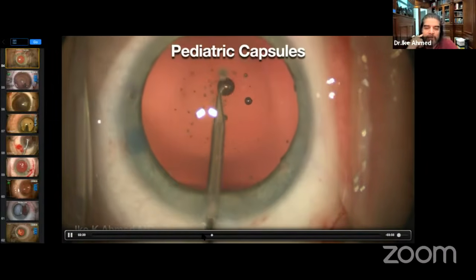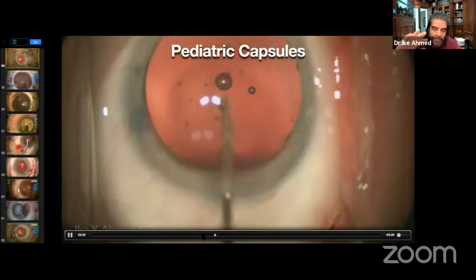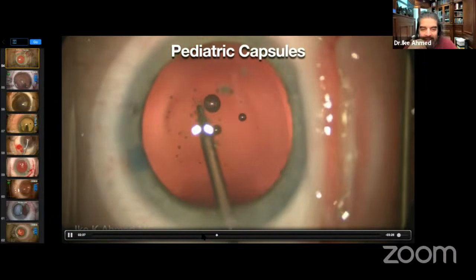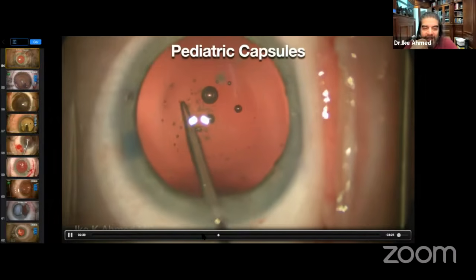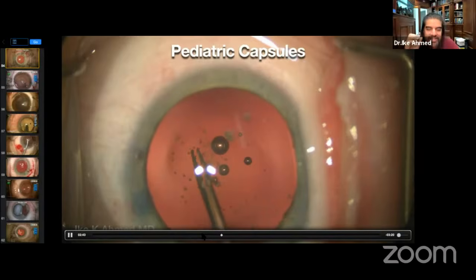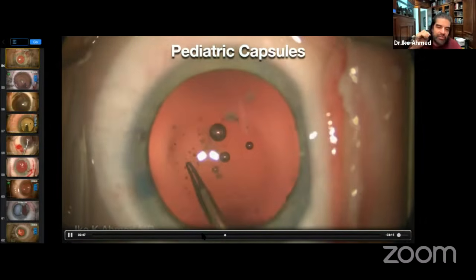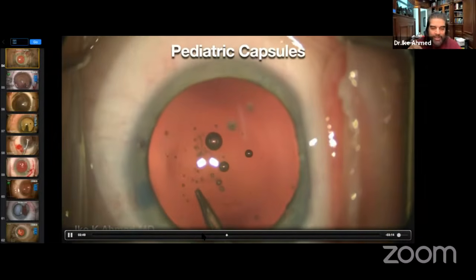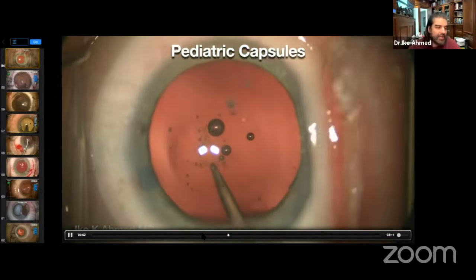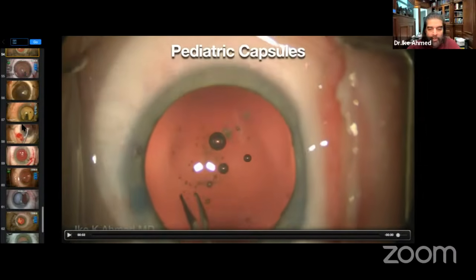And so it's helpful to use a microforceps. It's helpful to put viscoelastic behind the posterior capsule to maintain Berger's space and keep the vitreous back, keeping the anterior hyaloid intact. And then we basically need to regrasp. The big difference between posterior and anterior rexis is the need to regrasp frequently because it's very thin and not as controllable. So regrasp frequently. But really, if you can do an anterior capsular rexis, I believe you can reasonably do a posterior capsular rexis quite well.